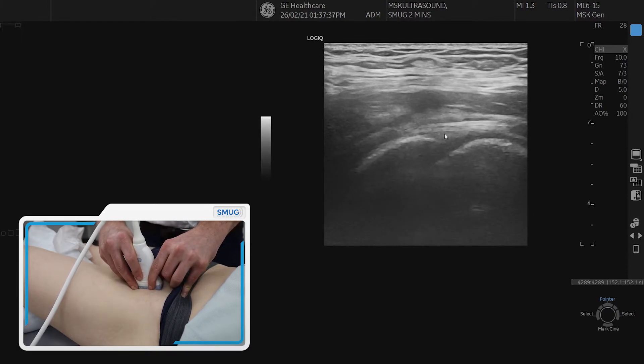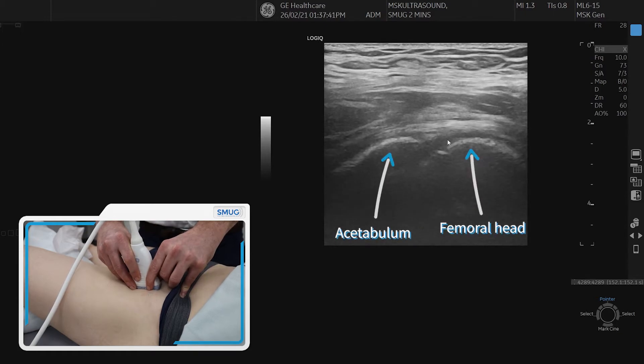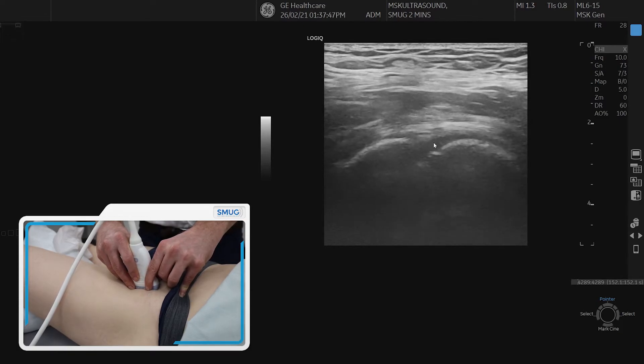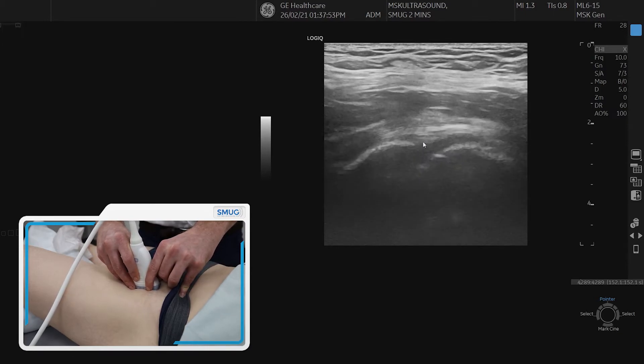It's really important to look carefully at that tendon, particularly above the joint, because sometimes we can see fluid around the tendon. We may think that that's bursal fluid, but actually a lot of the time, just like the long head of biceps around the shoulder, we actually see fluid around the tendon, but it's coming from the joint itself.